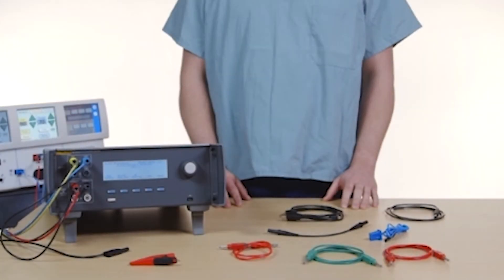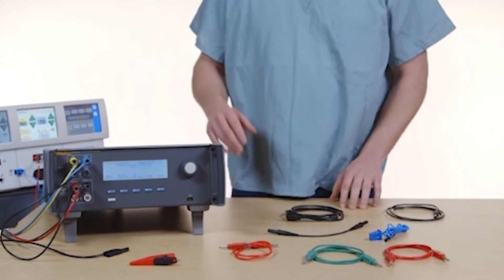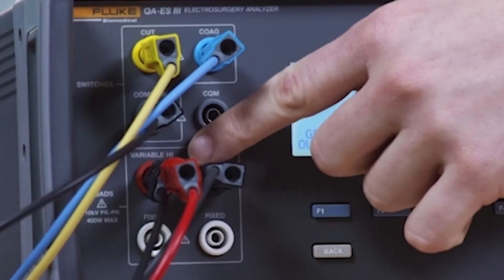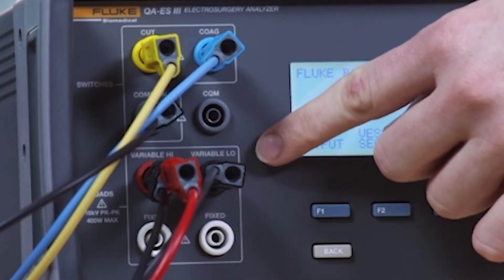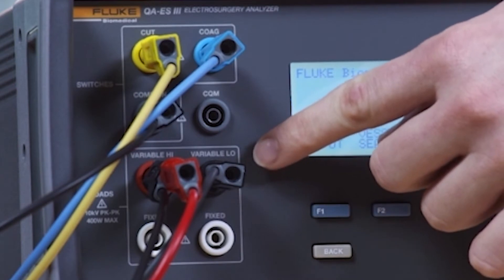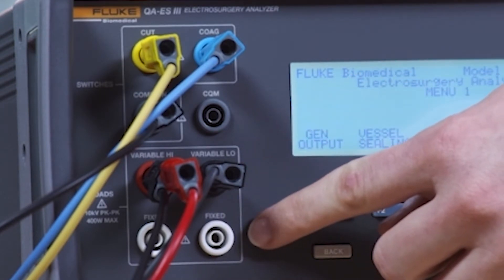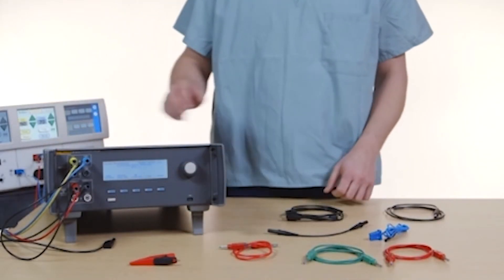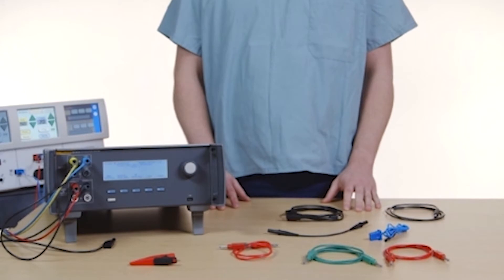For all HF leakage measurements, the QAES-3 places a 200 ohm load resistance from the variable high jack to the variable low jack and measures the leakage current through that load. Some measurements also use the fixed 200 ohm load at the 200 ohm jacks. The bipolar leakage measurement uses an additional internal 200 ohm load to earth that gets switched into the circuit.